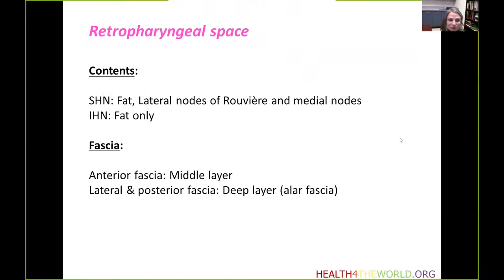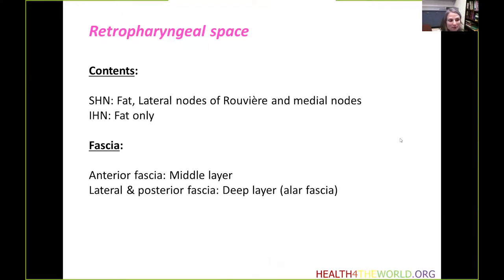Moving on to the retropharyngeal space. It's located in the midline, posterior to the pharynx and cervical esophagus, and extends from the clivus to the T3 vertebral level. Its contents change depending on the location: in the suprahyoid neck, the retropharyngeal space contains fat, as well as the lateral nodes of Rouvière and medial nodes. In the infrahyoid neck, there is fat only and no nodes.